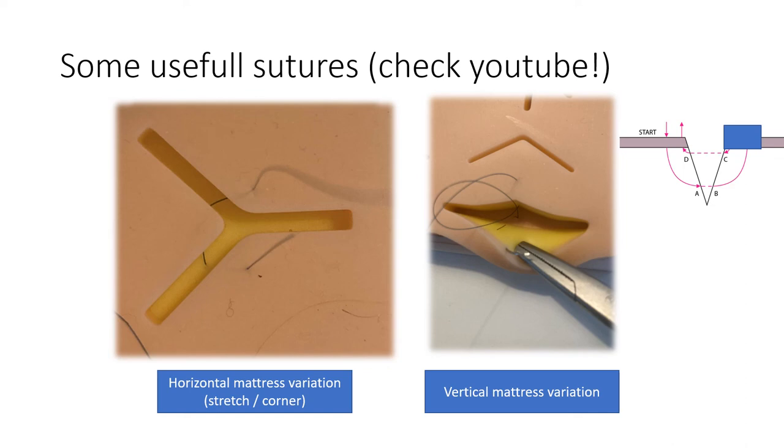This requires you to pull quite a lot on the skin to make that bow, but it's fewer holes in the patient. Again, do what you know in the situation. These I use when there are difficult wounds or wounds that have traction on them. And when the traction is gone, I'll just suture in neutral. I'll try to do a method where you suture halves. So if I've done a suture here first, then I'll take the half of that, and then I'll take the half of that.